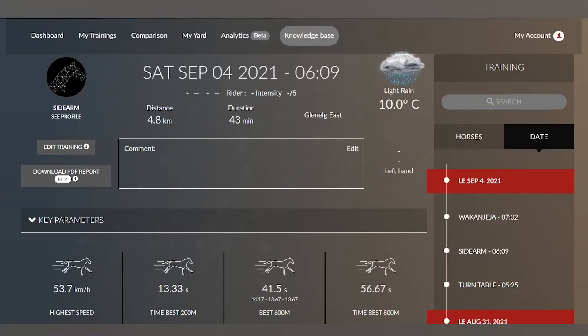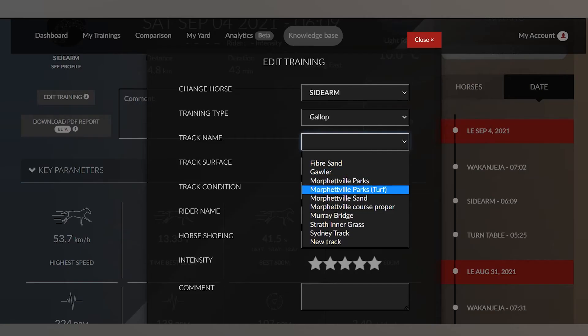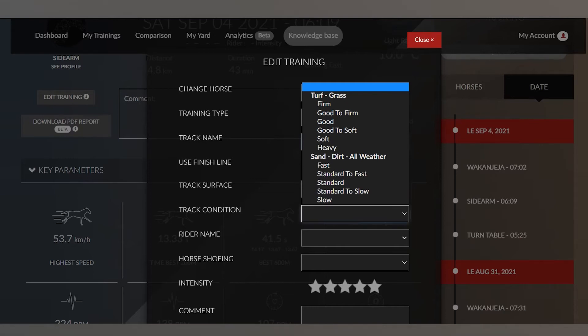We've got Sidearm's profile from the session here this morning. You can input what track they work on, and that helps you compare how they've worked on different surfaces and track conditions. You can also input the rider so you have a historical record of which rider has ridden which horse on a particular day, and see if a horse goes better for one rider than another. It's especially important on grass tracks to input the grade of the track — whether it was slow or fast — because that's important for drawing historical comparisons.